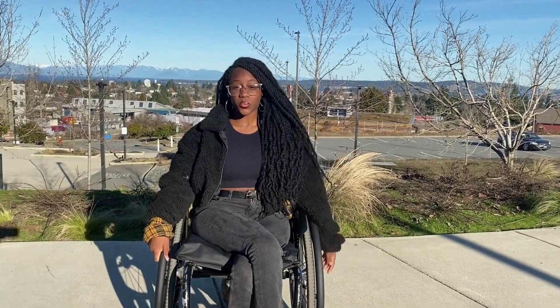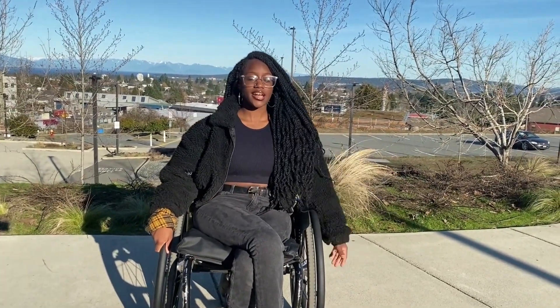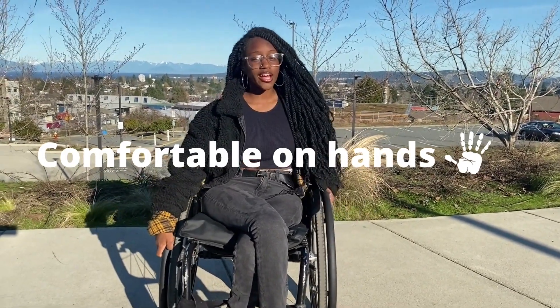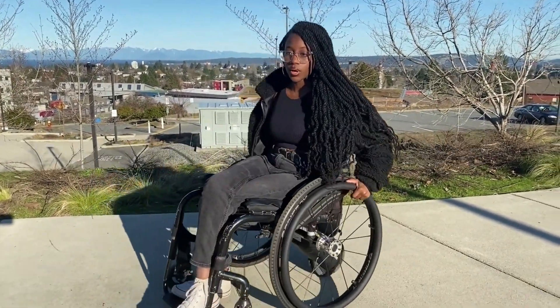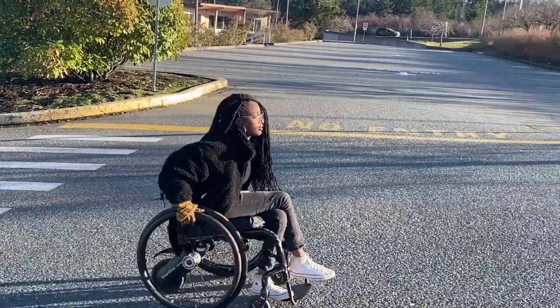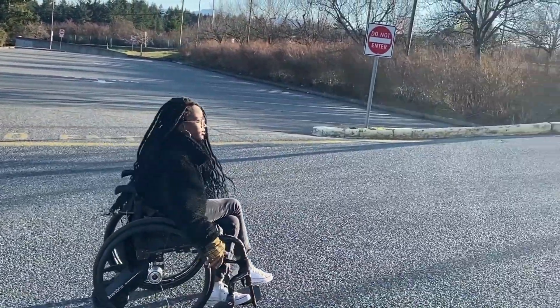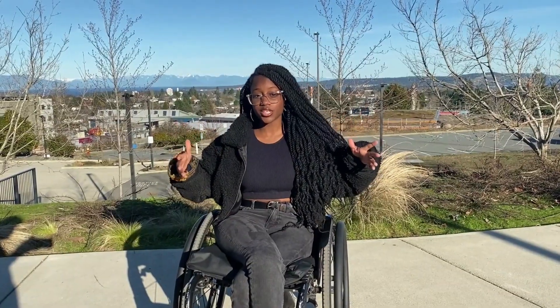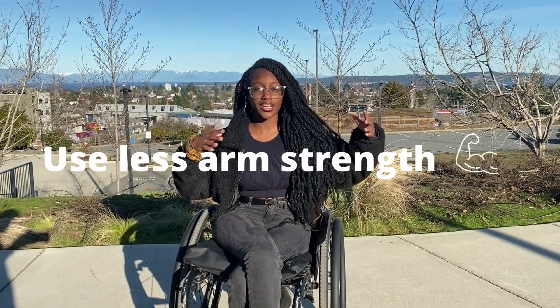So I've actually had these push rim covers for about a week, and off the bat I would say that I love how great they feel on my hands — how comfortable they are. I feel like I don't really have to grip as much when I'm pushing uphill or even just generally, and I'm able to use less energy when I'm pushing. For wheelchair users, that's pretty awesome because we're using our arm strength a lot anyways.